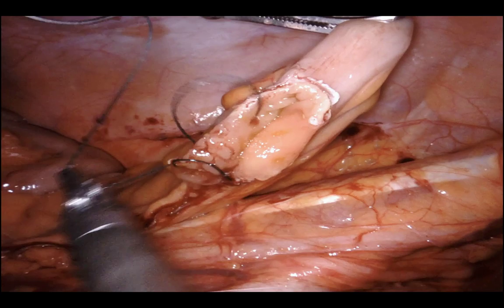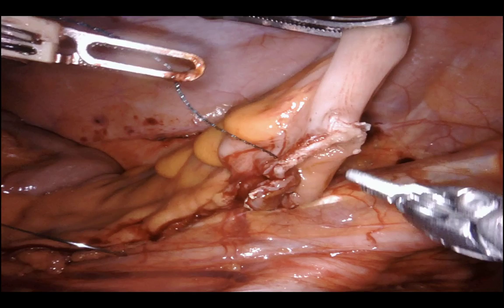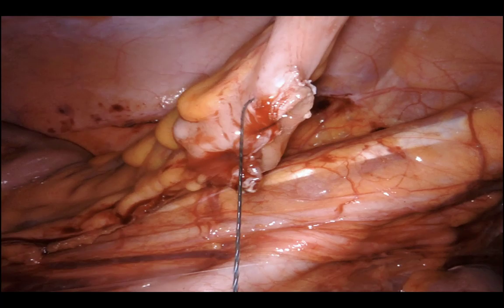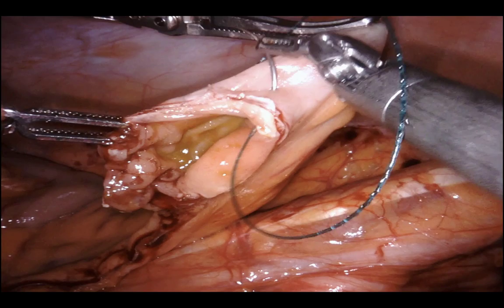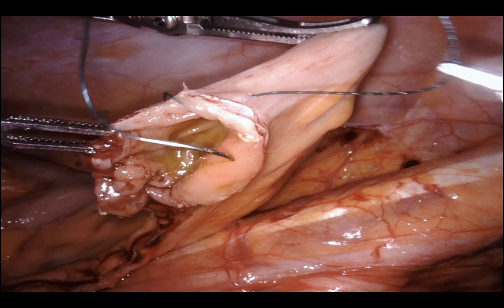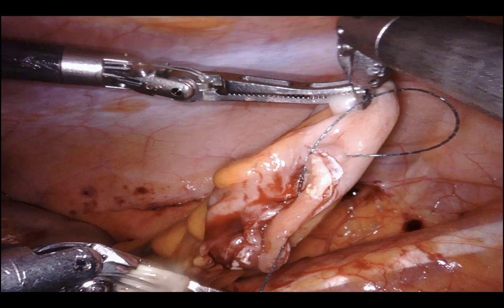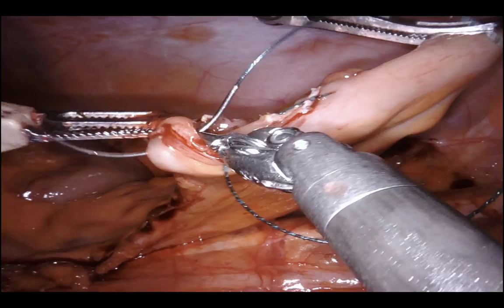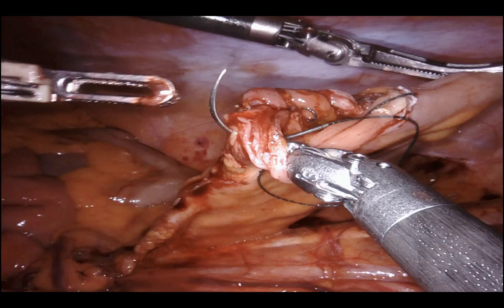I do this in about one-centimeter increments, taking a five-millimeter bite each time. I know the measurements because my left-hand bipolar instrument is five millimeters jaw-to-jaw and two centimeters tip-to-tip open, so I split the difference — travel one centimeter, take a five-millimeter bite. I go clockwise from seven o'clock back to seven o'clock.